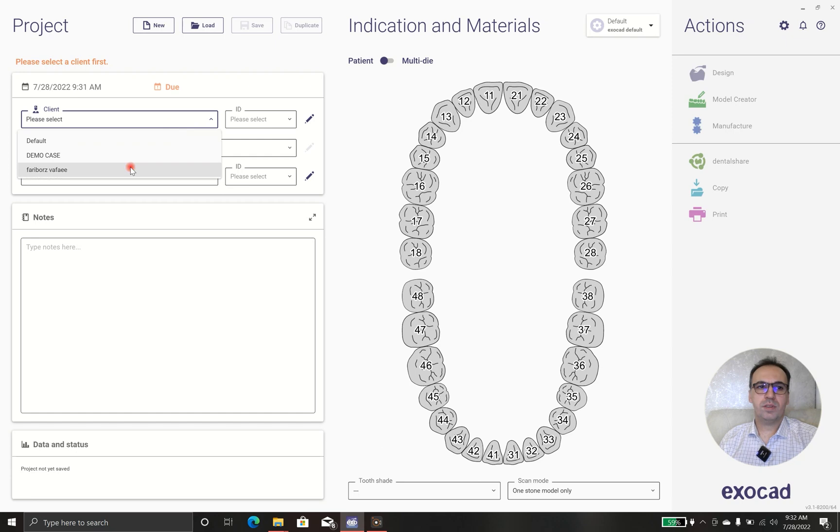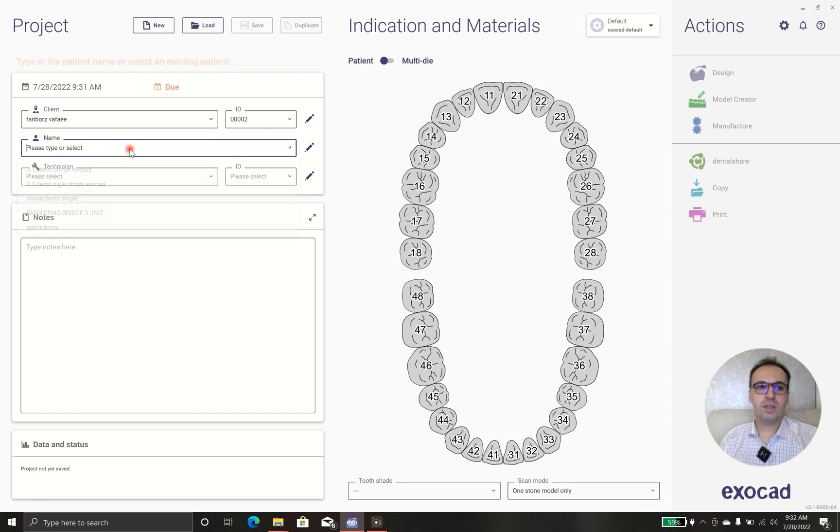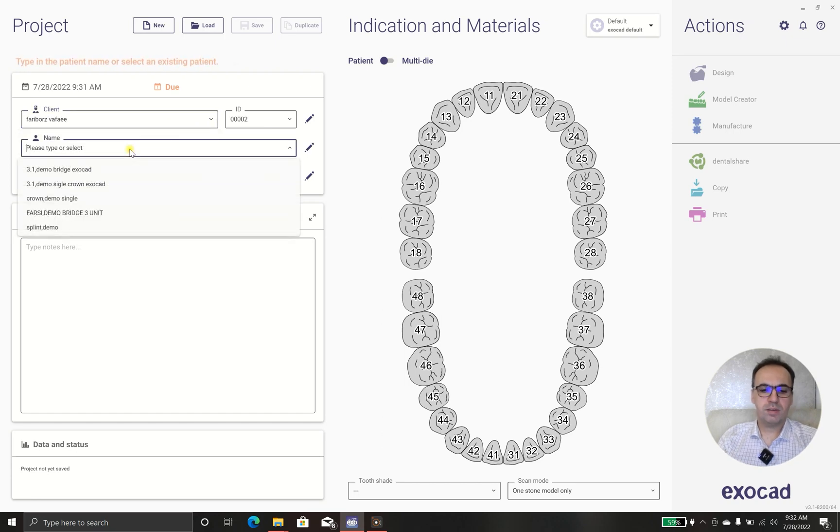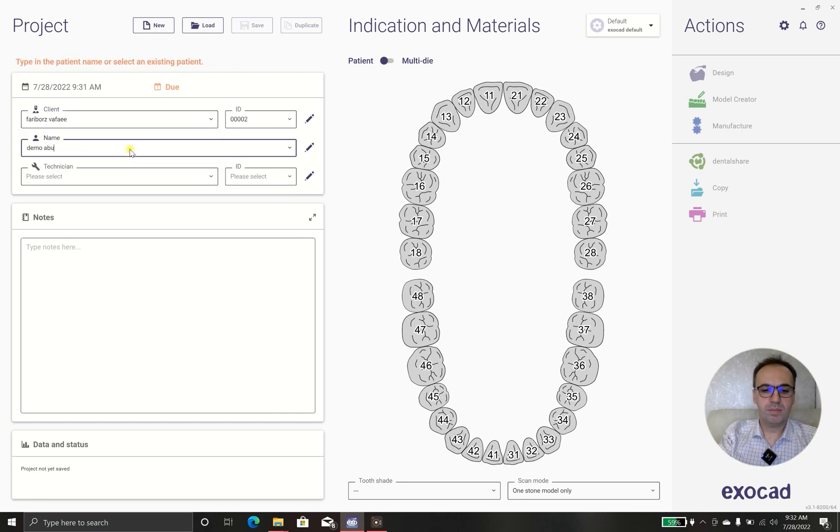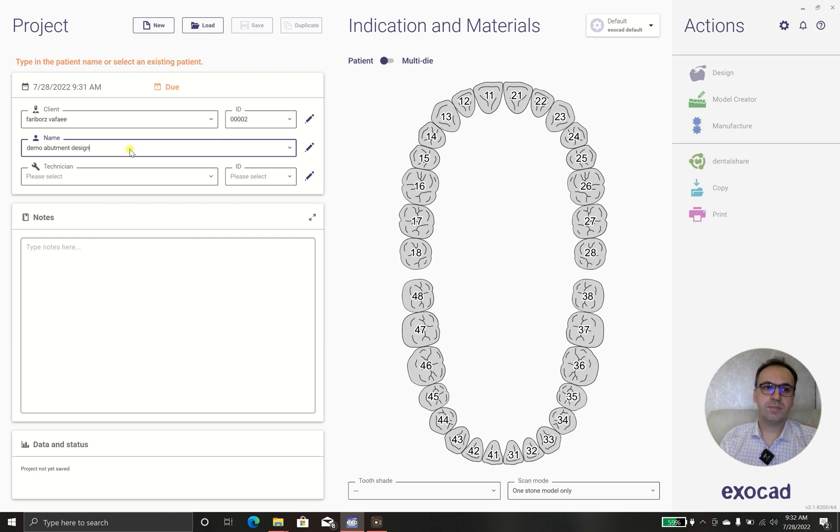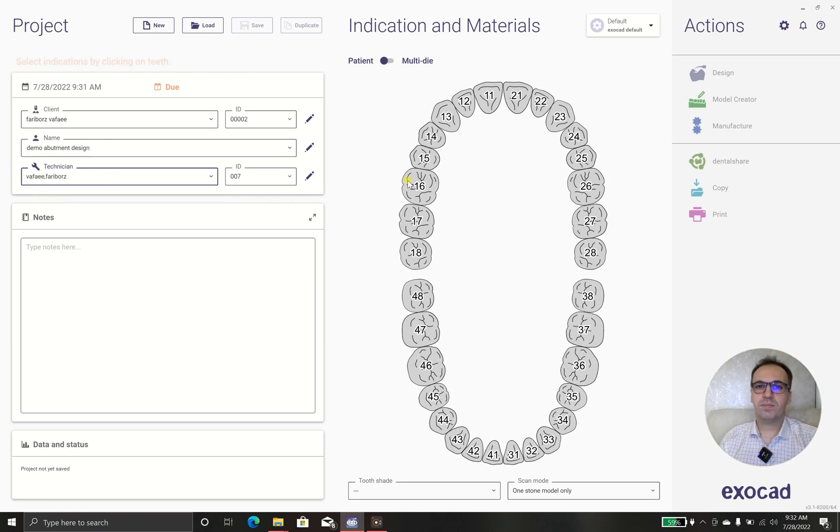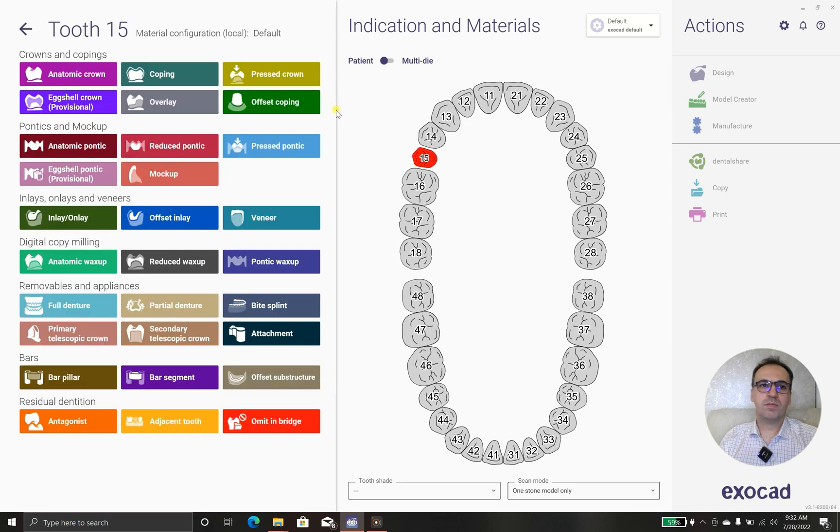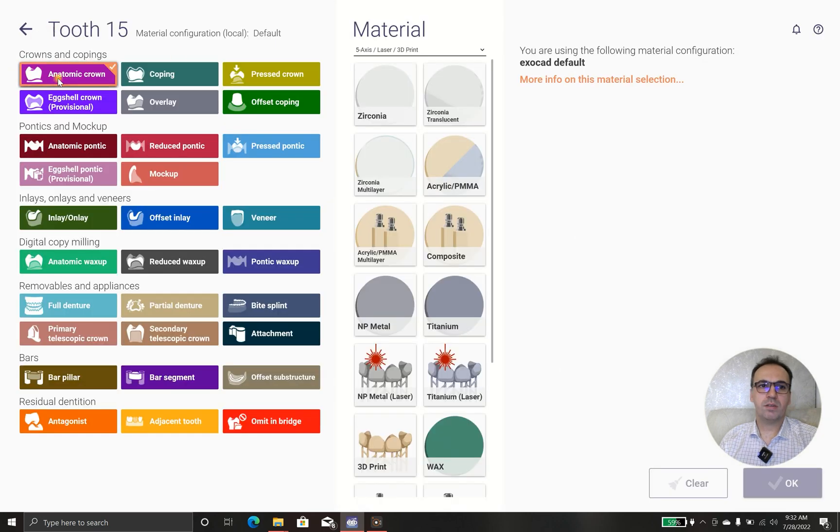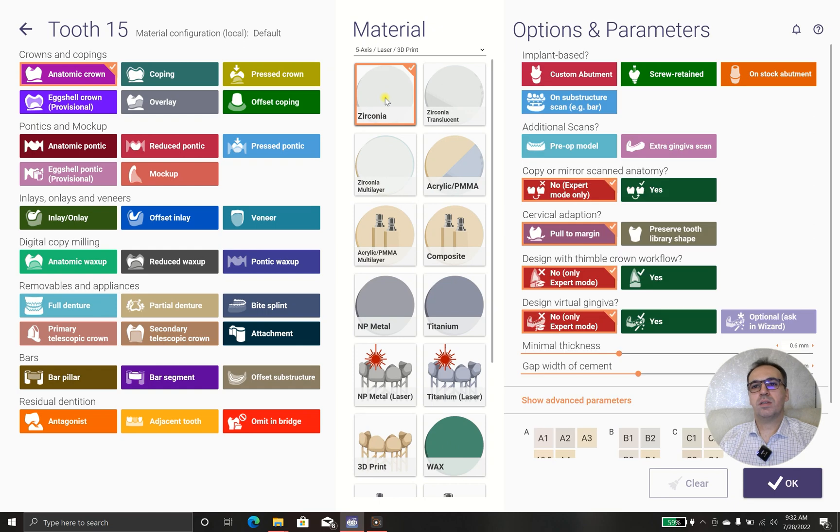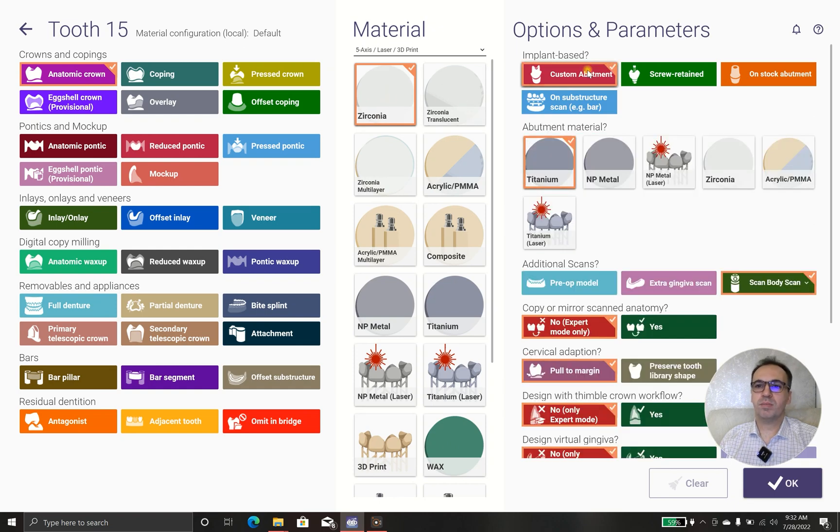Okay, first we have the client demo abutment design and the technician, myself. In this case we have tooth 1-5 and we want to have anatomy tooth and zirconia and I want to make custom abutment.